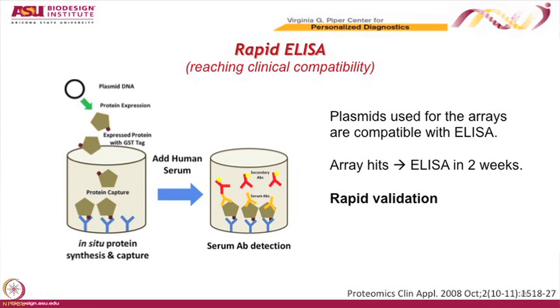So if you remember from my second talk where I showed you those 96 well plates, the early NAPPA, that's what we're doing here, but in a more routine way. And we can do this to the point where I think it costs less than $1 per well to do the assay. So in the big picture, that's pretty good, especially because we can set up one of these ELISAs for just about any protein within a couple of weeks.